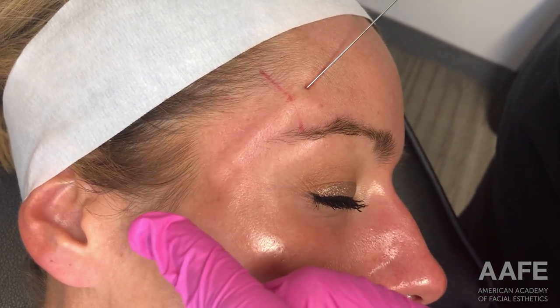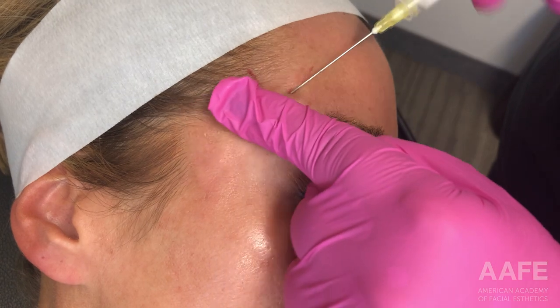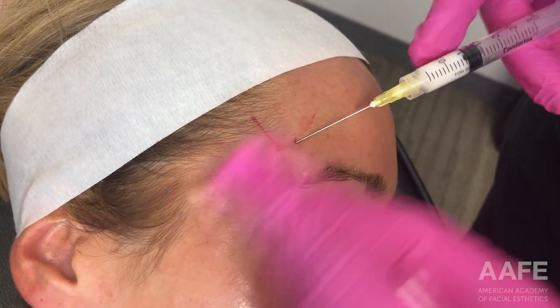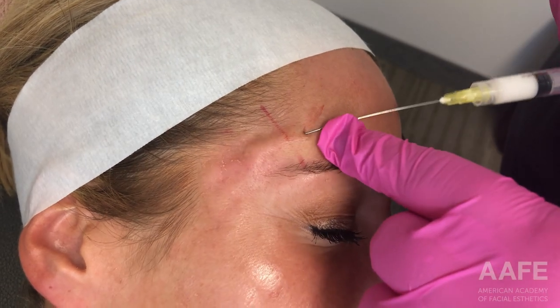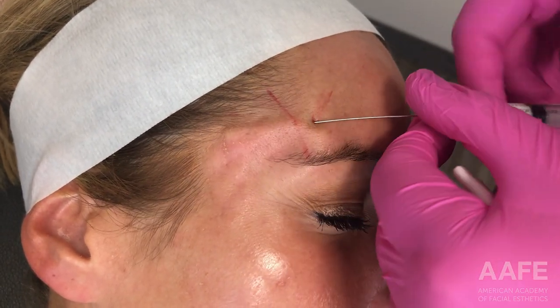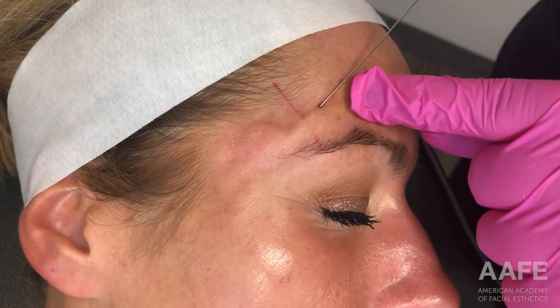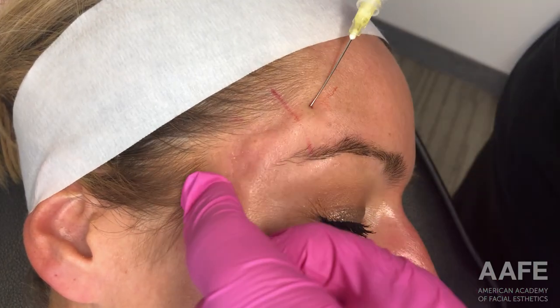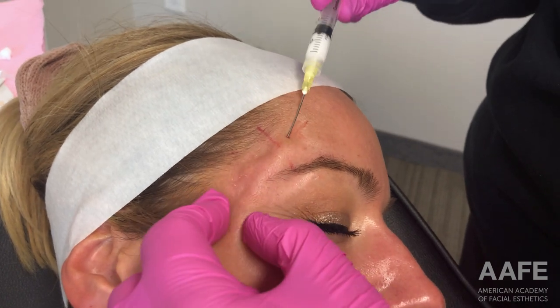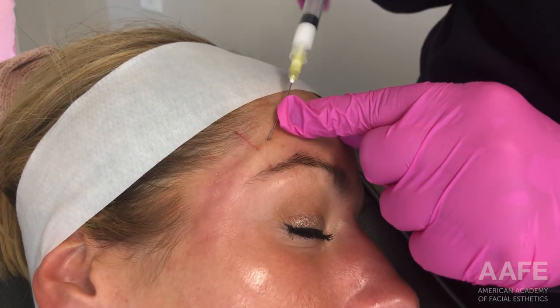For this particular patient, we also did some treatment in her upper and lower face. She had a total of four syringes that day — three syringes in the face at a one-to-one dilution, which included the temples plus upper and lower face. We did one syringe at a three-to-one ratio, meaning four and a half cc's of saline to one and a half cc's of Radiesse, and we used that in her neck to help with necklace lines and skin texture. That three-to-one ratio is great for a kind of power-washing of the neck to address the effects of aging there as well.